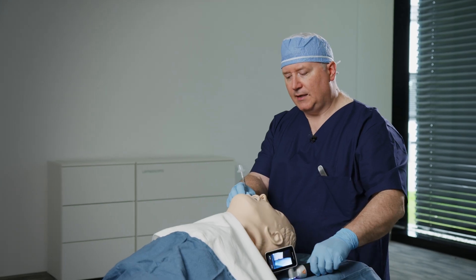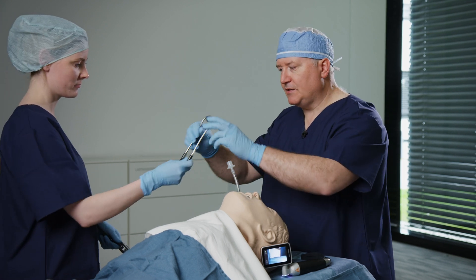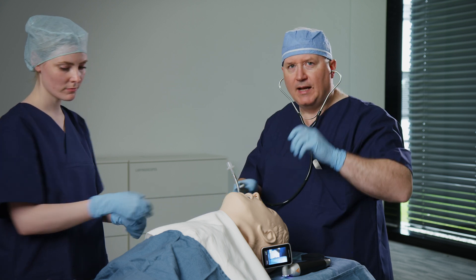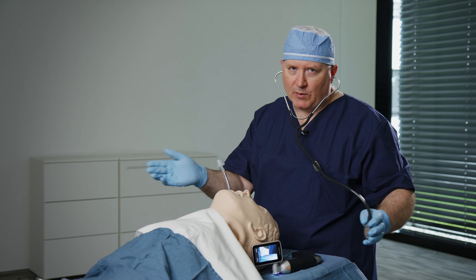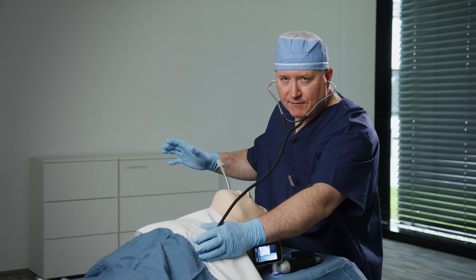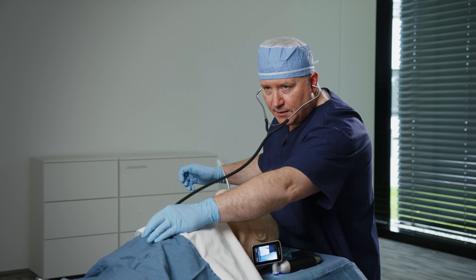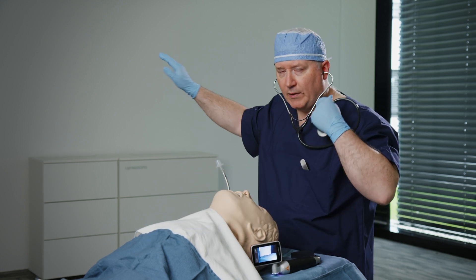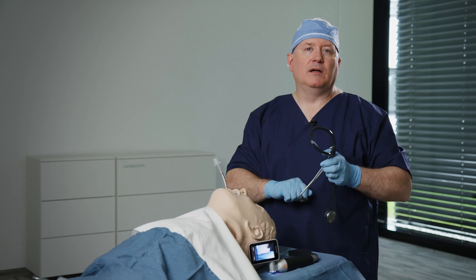As I connect the patient to my breathing circuit, whether it be a bag valve device or a ventilator, I want to make sure that I haven't placed the tracheal tube into the right main stem or even the left main stem. That can happen, but right main stem is more common. So as I'm ventilating, I have breath sounds — equal breath sounds, left and right. Nothing over the epigastrium. And I have end-tidal waveform CO2 to signify that I have proper placement of the tracheal tube.